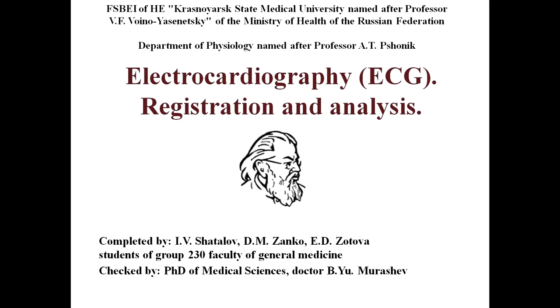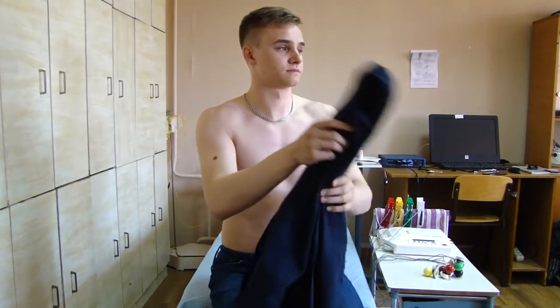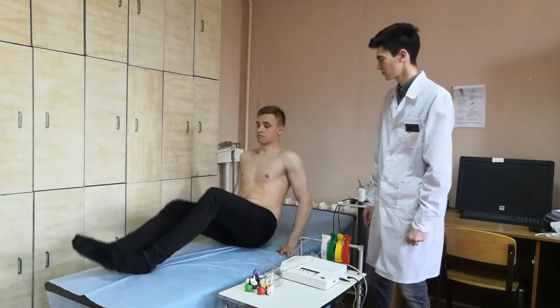ECG registration is carried out in the supine position. At the beginning of the ECG, it is necessary to ask the patient to undress to the waist, take off his shoes and take off his jewelry. We ask the patient to lie down on the couch.